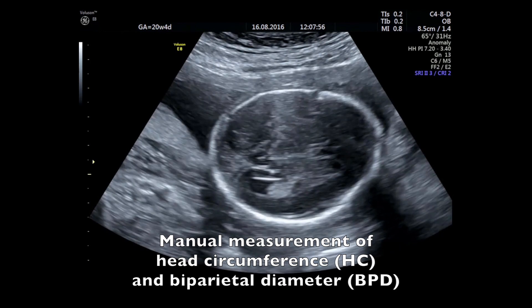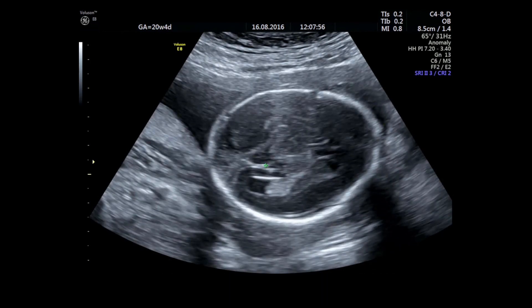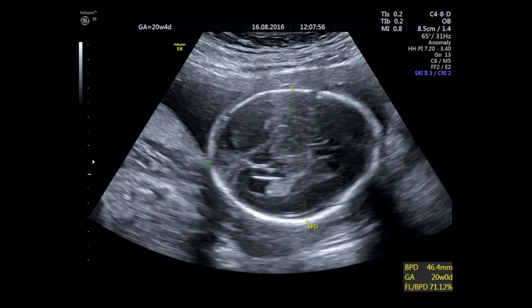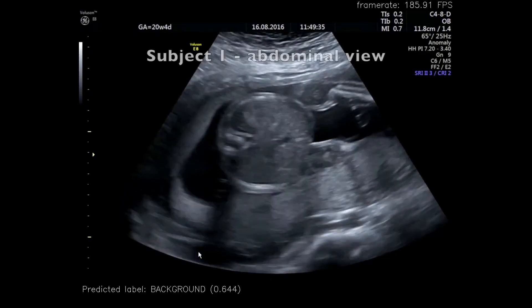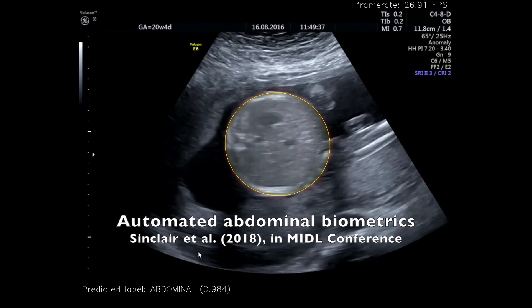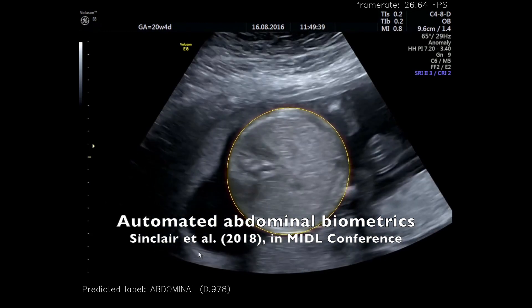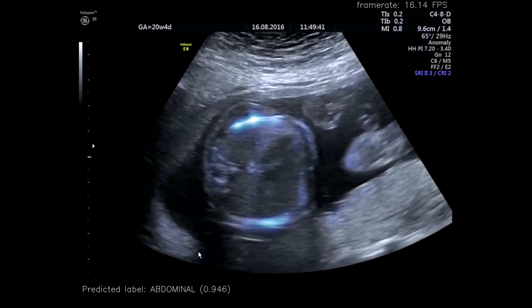Fortunately, what we've done here is we've collected a large number of patient cases — approximately 2,000 subjects — from whom we also have the annotations. What this allows us to do is train a model to learn to segment and annotate these images automatically. What we found is that using deep convolutional neural networks, we've been able to reproduce inter-observer variability using our model for the annotation of both the abdomen and the head.